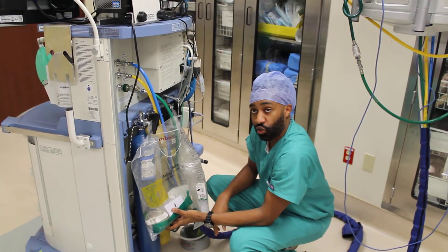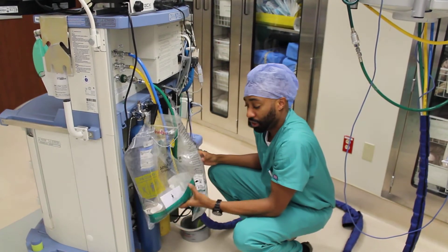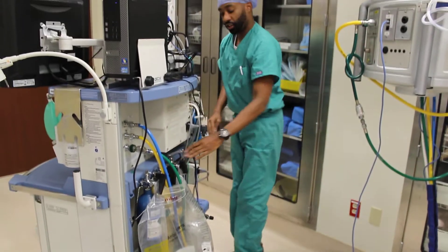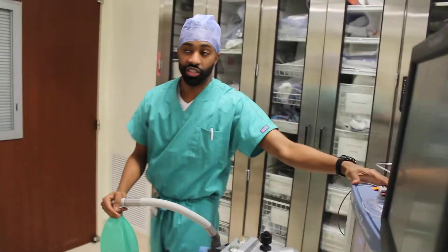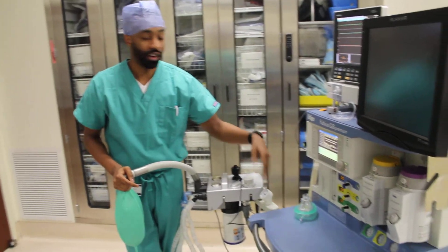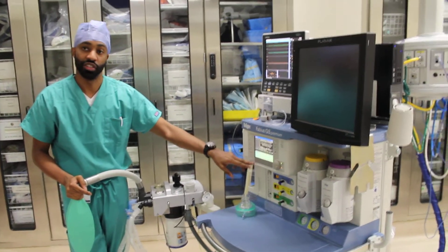We have our emergency equipment — our pediatric self-inflating bag and our adult self-inflating bag with a mask included. We open up our cylinders, come around, turn on our anesthesia machine, and check our scavenging unit and our CO2 absorbent. At this point our machine should be going through its own system check before we begin our own leak compliance test, to calibrate our O2 sensor and to calibrate our flow sensor.